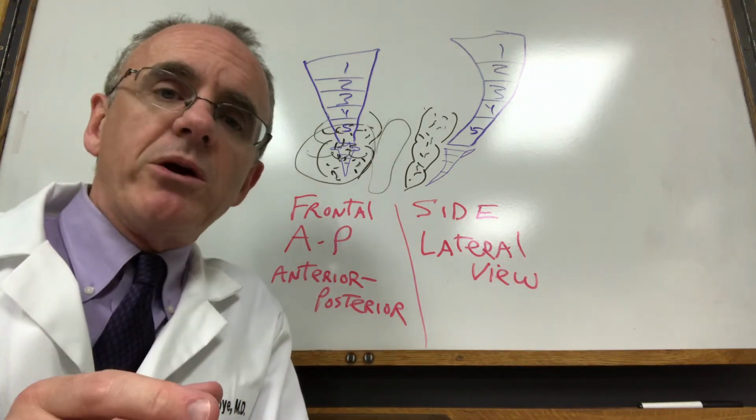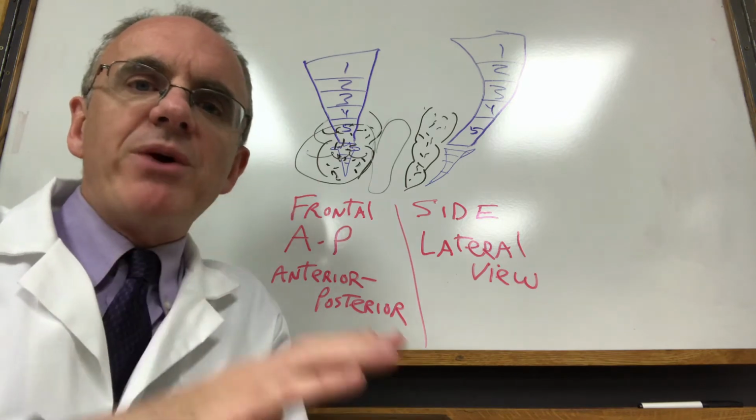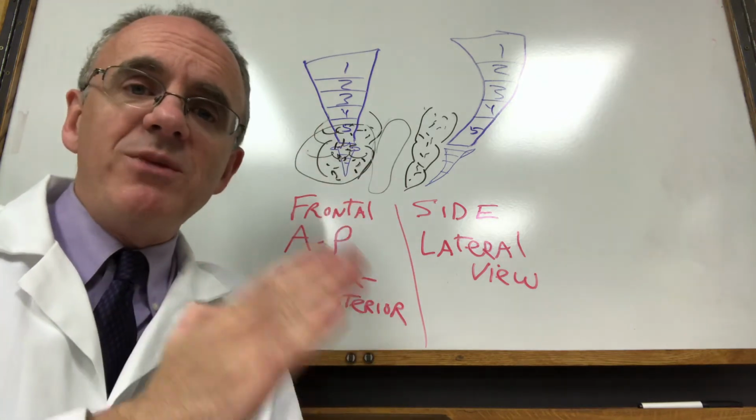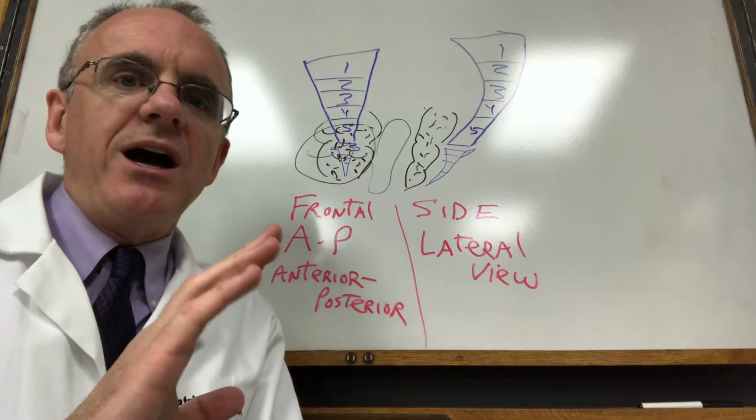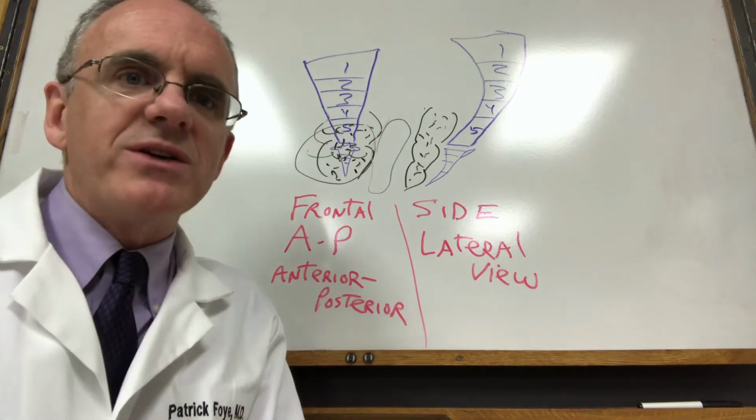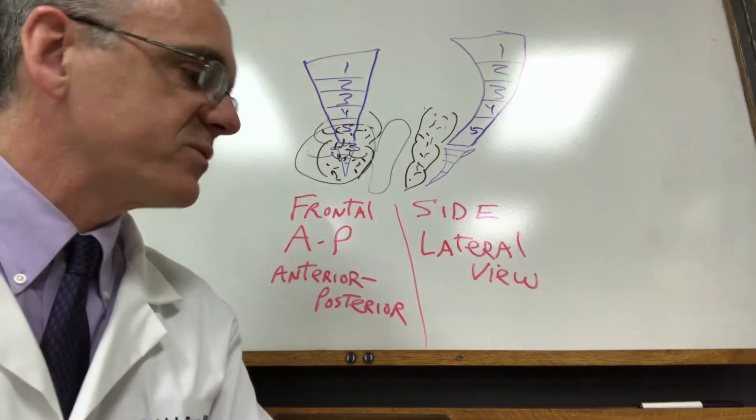This is different if we are looking at MRIs and CT scans, because those take images in slices. There are some corollaries for those, but I'll probably go into that in another video because it'll just get too long to say it all on this one.